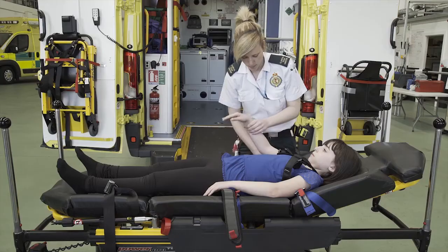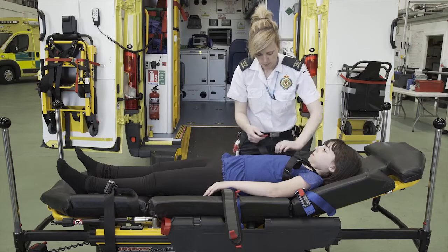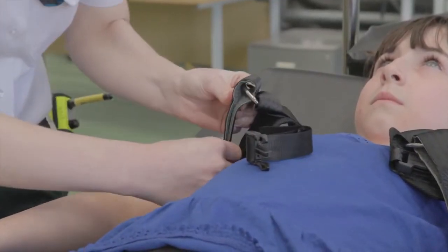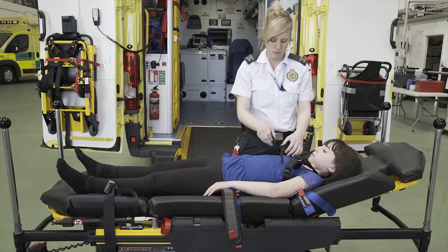Firmly press together, ensuring the white marker has cleared the D-ring for maximum engagement. Repeat this on the other shoulder and then secure the chest strap.